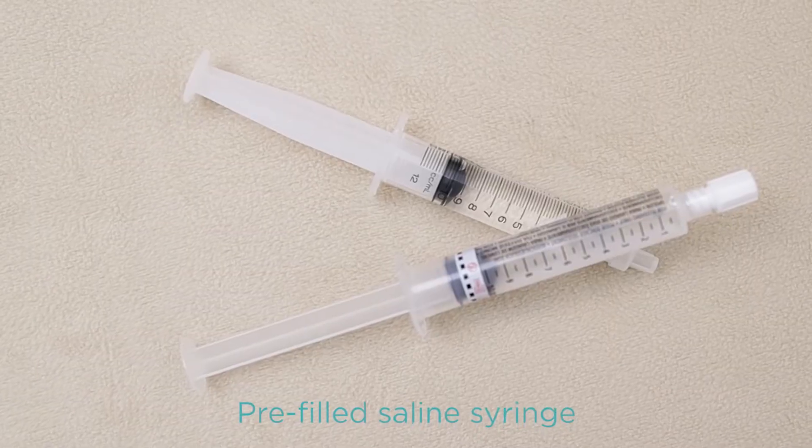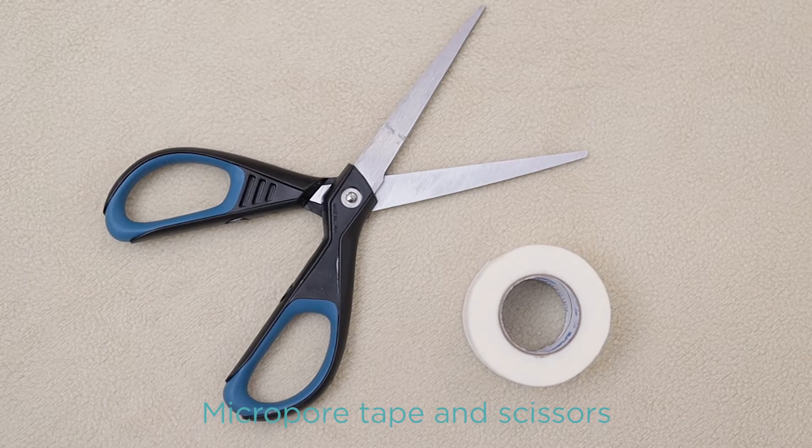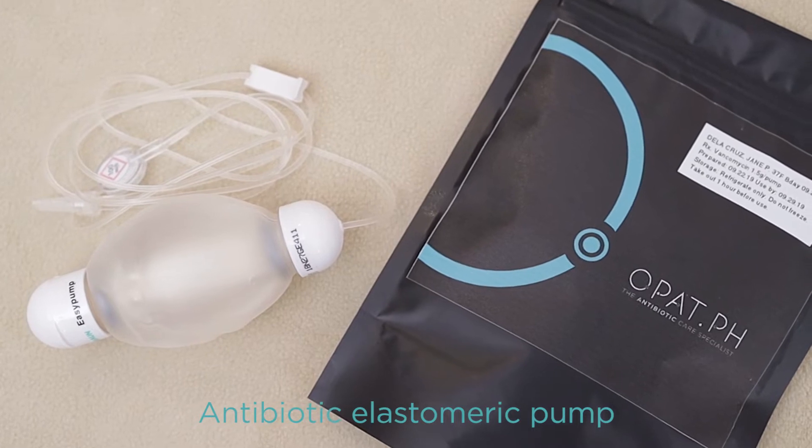You'll be needing two pre-filled saline syringes, a disinfecting cap, micropore tape, scissors, and your new antibiotic elastomeric pump.